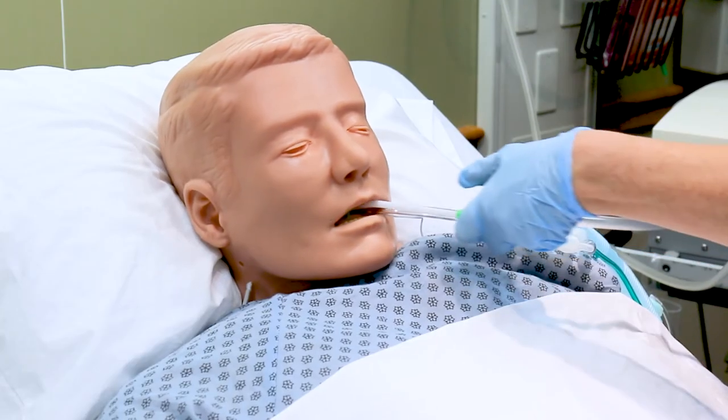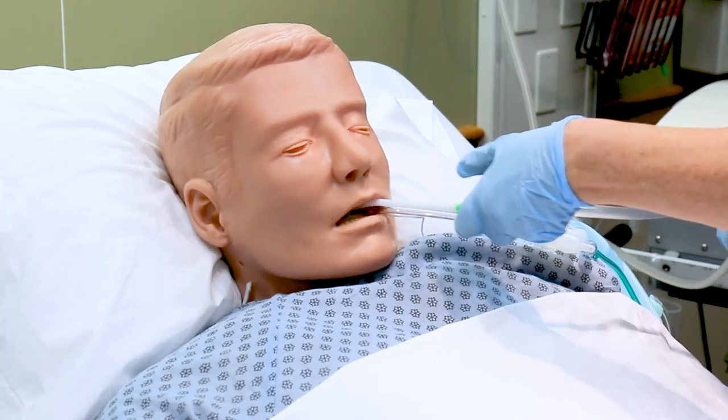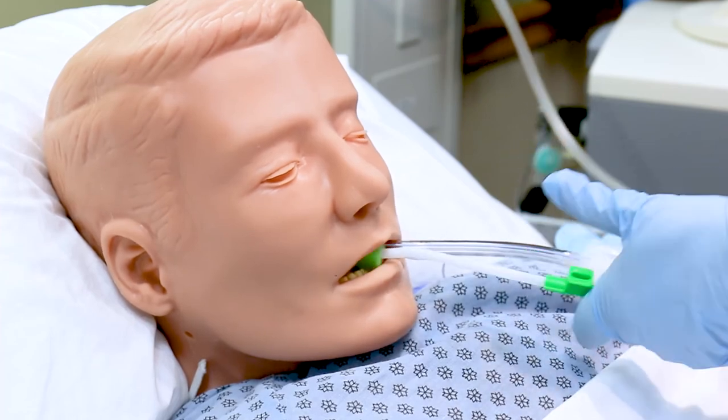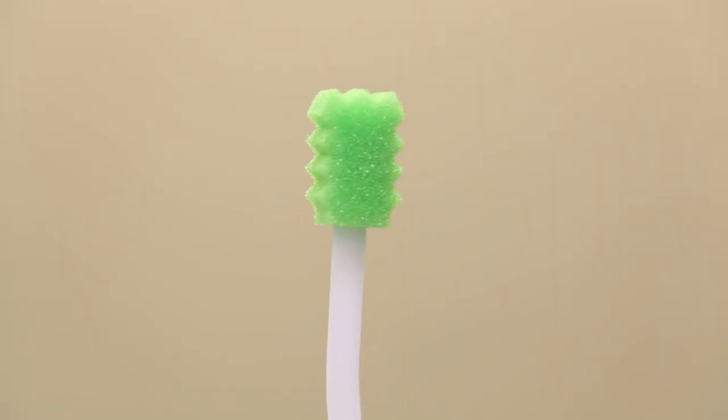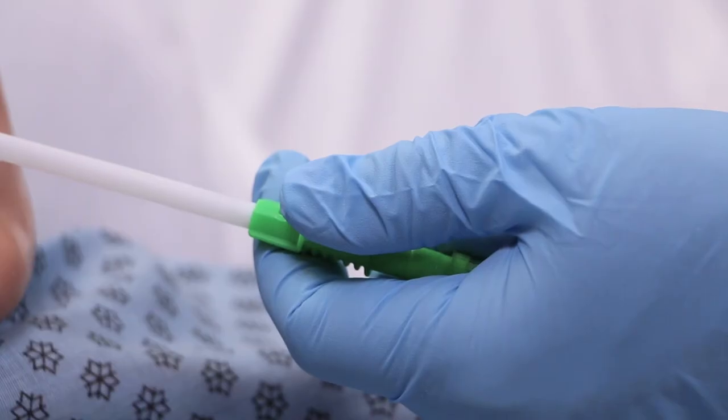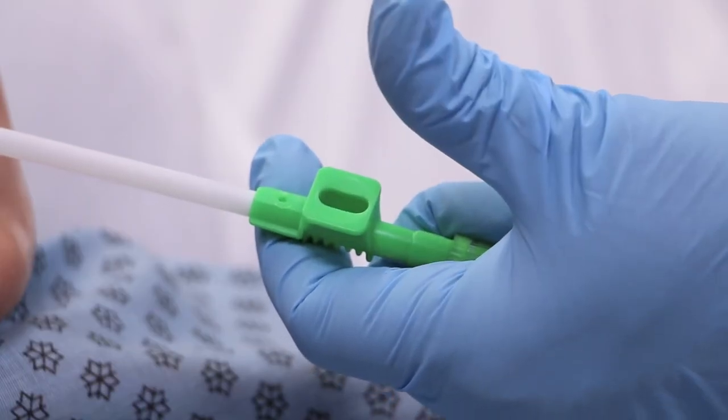Clean the teeth and swab the sides of the mouth with the suction swab for approximately one minute. The perpendicular ridges on the swab help clean the mouth and between teeth. When you're finished, remove your thumb from the suction port.